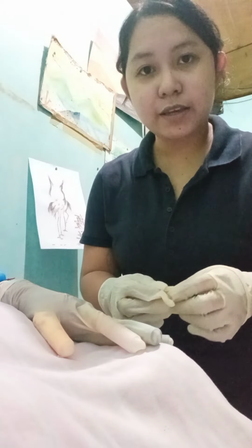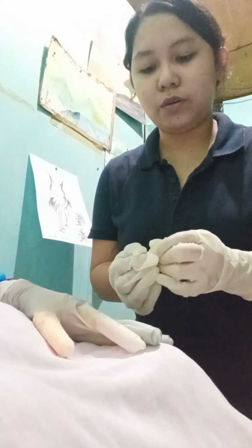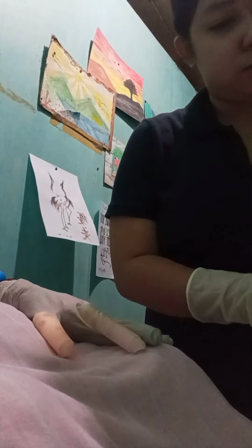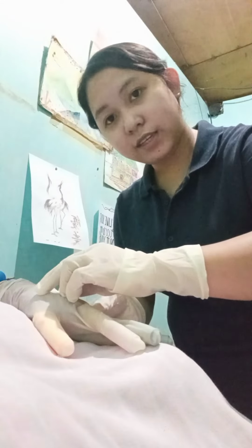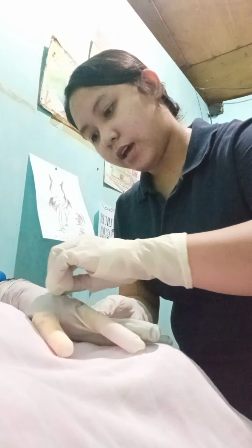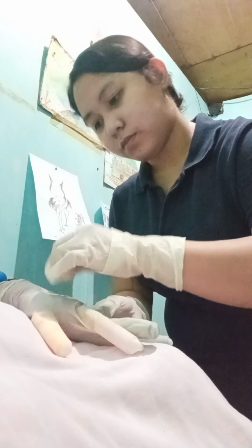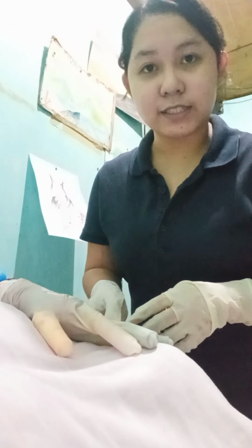Then, clean the vein area using an alcohol swab or cotton balls with alcohol. Clean it in a circular motion from the vein to the outside 2 inches. Dispose and let it dry for at least 60 seconds.